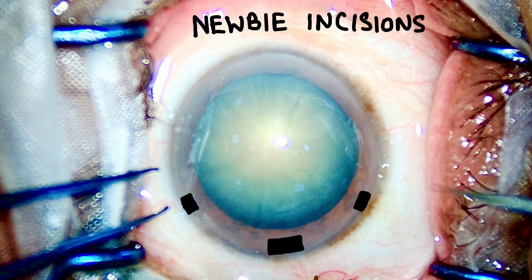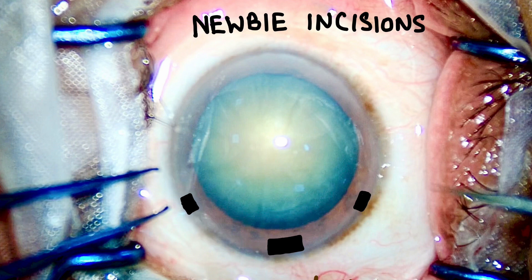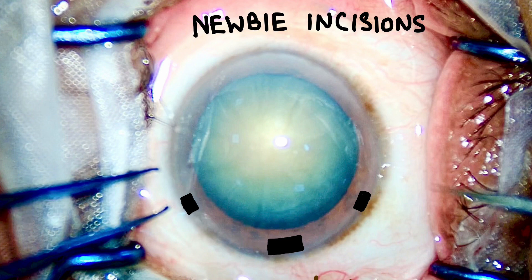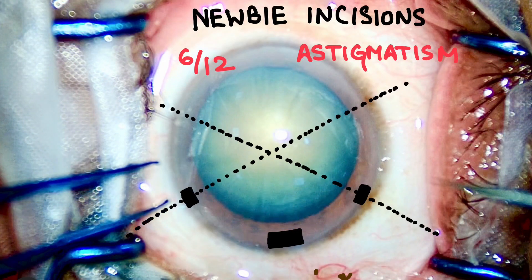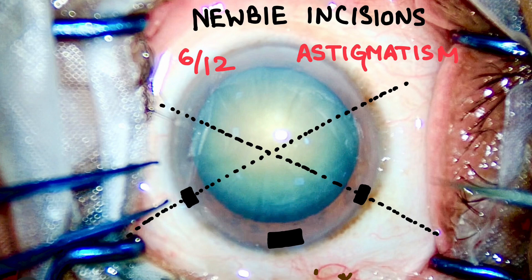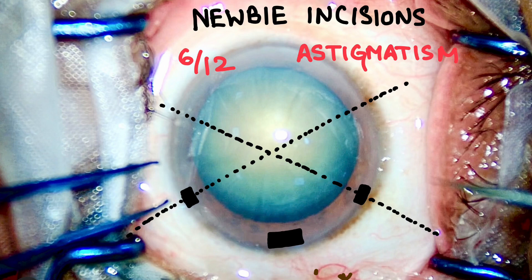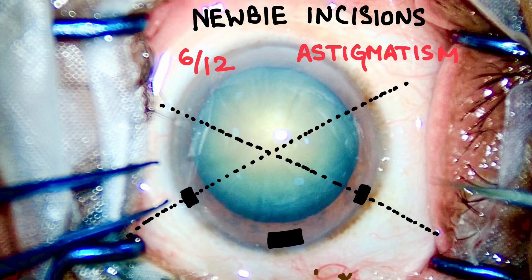The second mistake new surgeons make: the gap between the side ports and the main ports is less than three clock hours. The minimum gap should be three clock hours, and the side ports are tilted toward the main port when they should be at the three o'clock and nine o'clock position. In the post-operative period, two to three months after surgery, you will see the uncorrected vision of the patient is only 6-12. When you investigate, the astigmatism caused by these mal-positioned side ports and main port stops vision at 6-12, and AR readings and refraction will reveal cylinder — resulting in an unhappy patient.